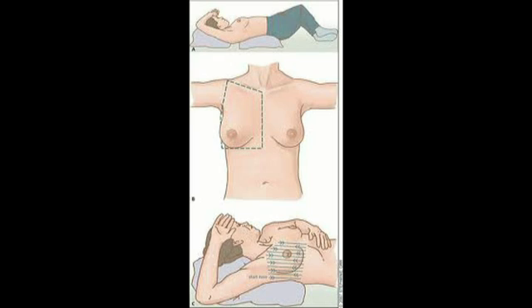Positioning the Patient. The patient is in the supine position with the arms elevated behind the head. This way, we put tension in the pectoralis muscles and flatten and fixate the breast against the chest wall. The same position is used in breast surgery, giving us the benefit of reproducing the ultrasound findings in the operating theatre.